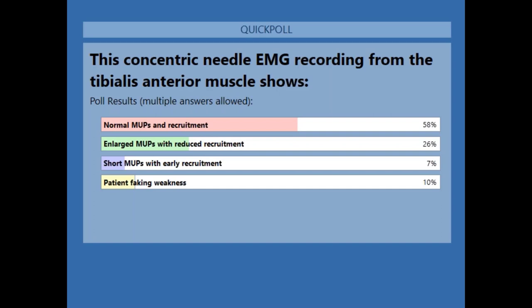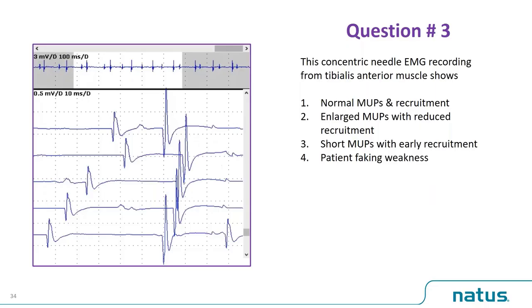The most important is what muscle is it, tibialis anterior, because the measurements do vary among different muscles. Again, based on quantitative analysis, we know some of the small muscles like first dorsal interosseus gives us very high amplitude. Triceps gives high amplitude. Biceps tends to give much less amplitude compared to triceps. Tibialis anterior gives high amplitude. Again, this is the information that we know from quantitative analysis. We cannot use a single vision to analyze each and every muscle.